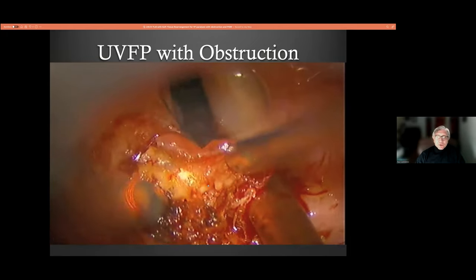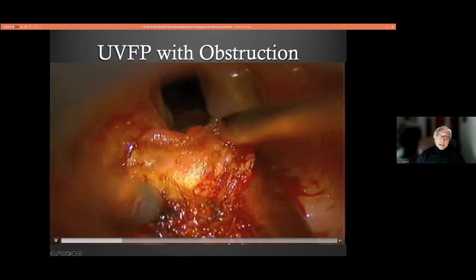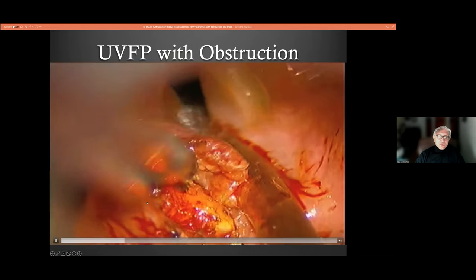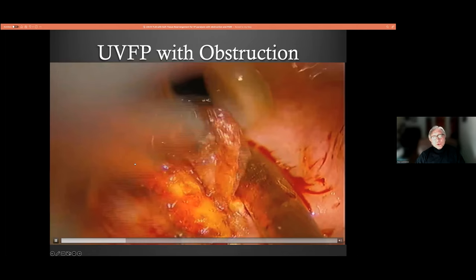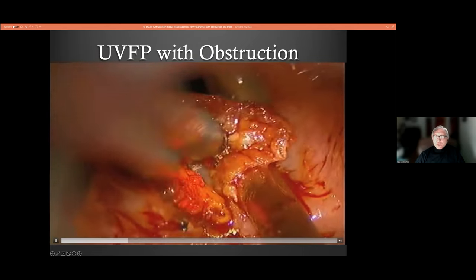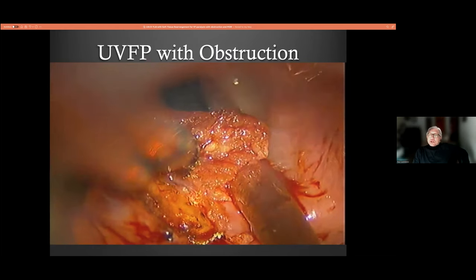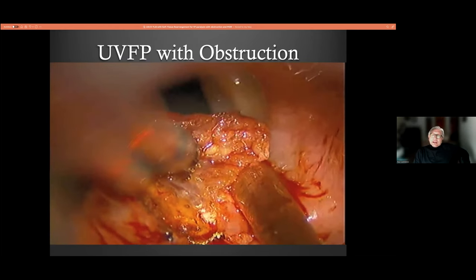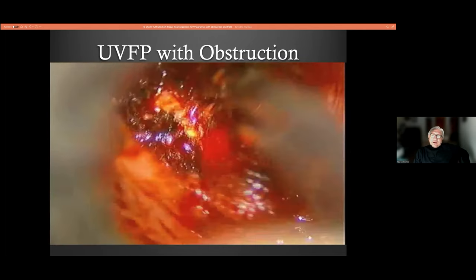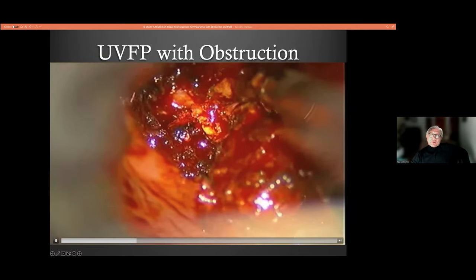As I got further along in this point, you can see I'm using a 1 millimeter circle with a scanning laser, and there's basically no char. I start realizing that this tissue that I'm about to remove could actually augment this cord well, as long as there was enough room between the two sides. That's why this procedure is called... this is the forming of the flap of tissue.